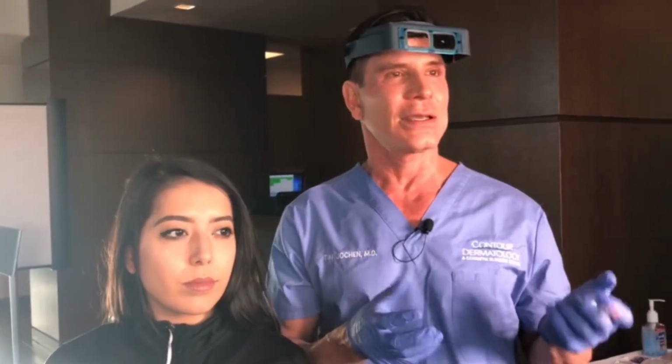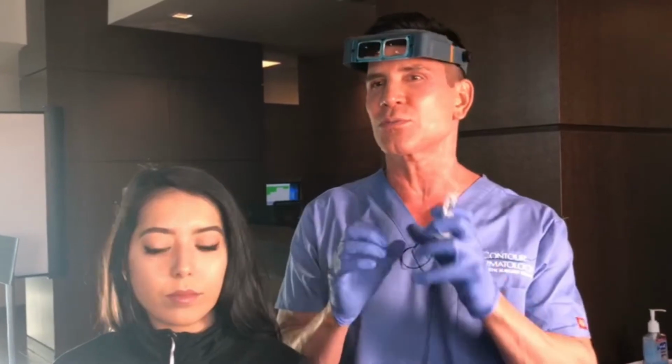With this product, one of the reasons I like it is because it doesn't attract a lot of water, which means it's not going to swell very much, number one. And number two, it really stays in place. Juvederm tends to move out a little bit and spread out a little bit. That's why I like it in the hands. But in the nose, we don't really want it to spread around. We want it to really stay in the position where we're looking to place it, if that makes sense.